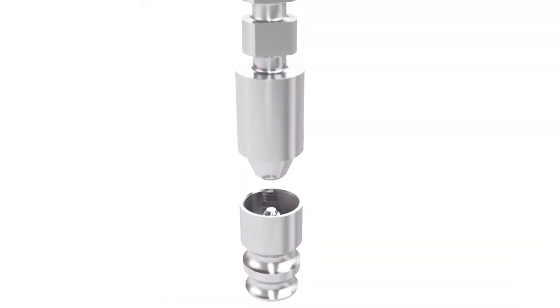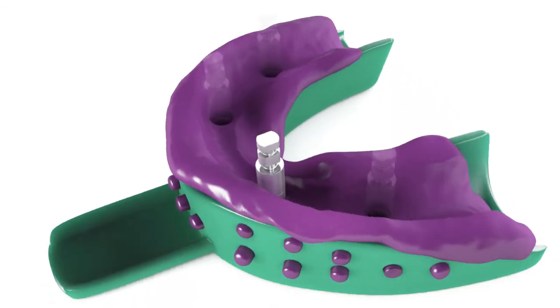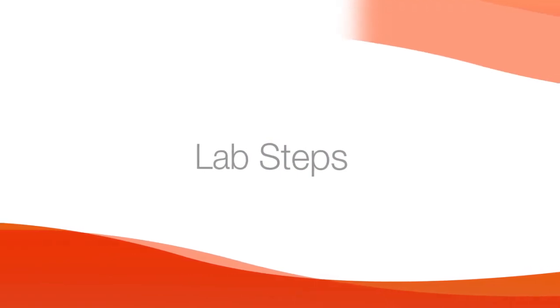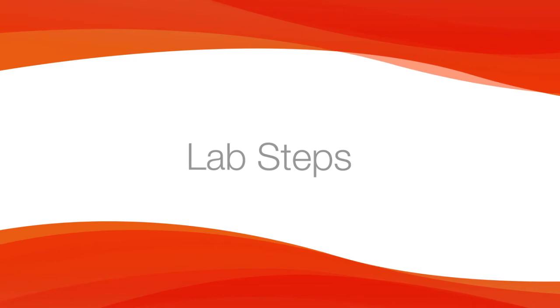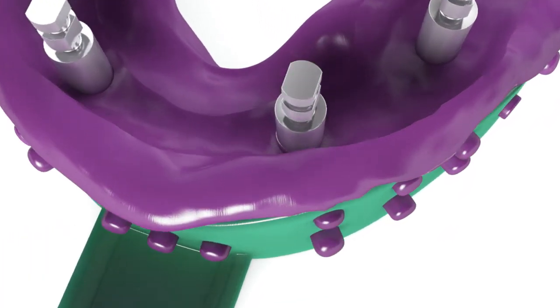Attach the multi-unit abutment replicas to the indirect copings and insert the assemblies into the impression. Send the impression to the lab. Verify that the copings and replicas are properly assembled.